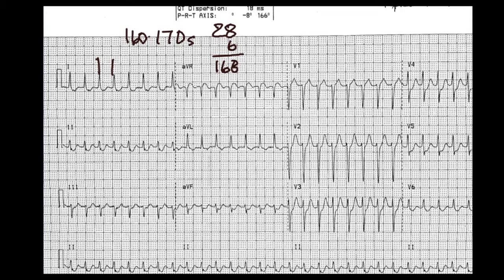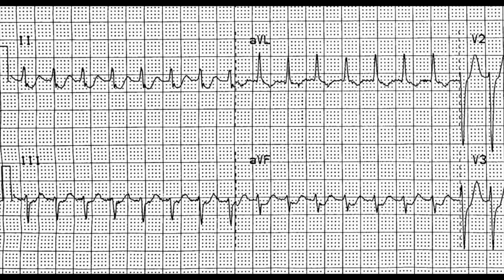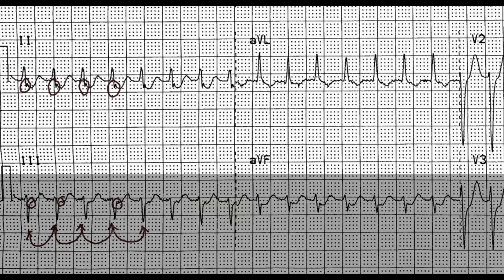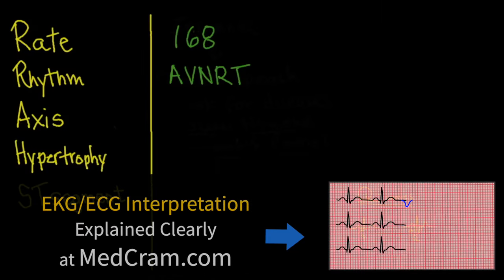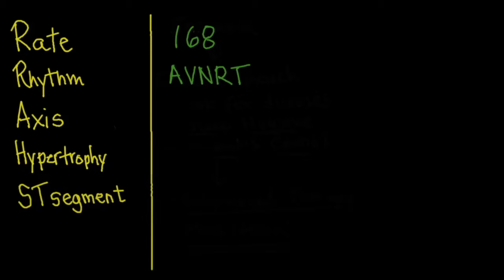This is a 10-second strip, so multiplying by 6 gives us beats per minute. That's rate. For rhythm, we look at each QRS complex to see if there are P waves and whether they're regular. Zooming in, you can see a little P wave after each QRS complex, with some notching. This is very fast — tachycardia — and also very regular, with P waves after the QRS. This pattern is consistent with AV nodal reentrant tachycardia, so the rate is 168 and the rhythm is AVNRT.